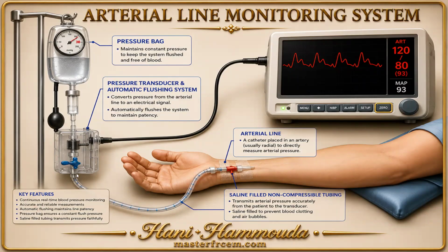It's very easy. So you have here a three-way. Three-way is down or up? Down. Once you hold this transducer in the exam, put the three-way down. You will find 3 points. One tubing to attach to the cannula. Tubing like the same tubing of the normal saline, right? Yes. And you have tubing to attach to the normal saline bag. And you have a cable. You will attach this cable to the monitor.